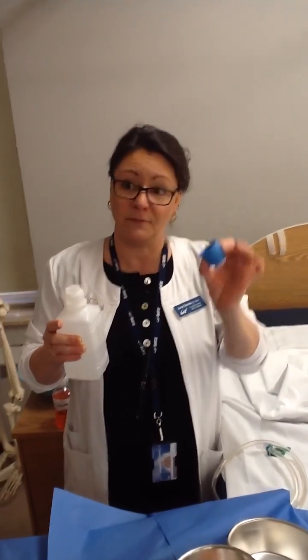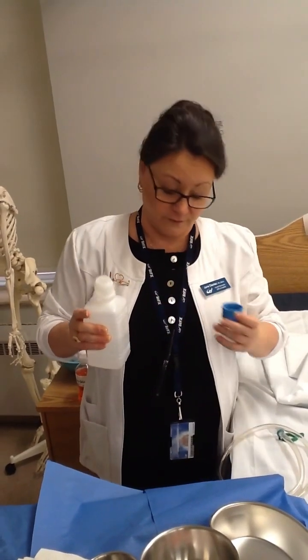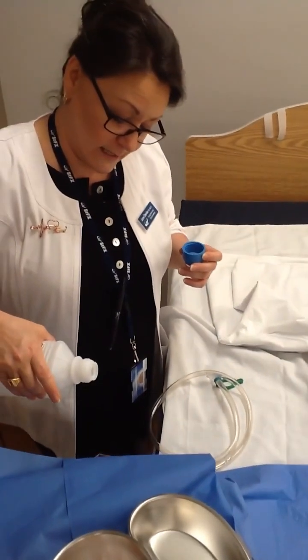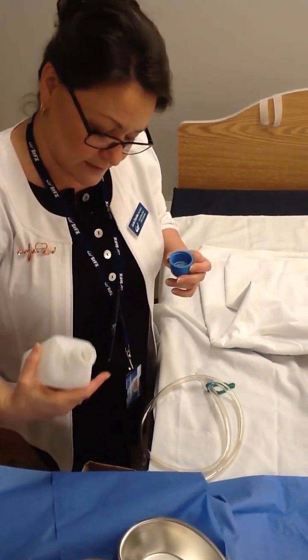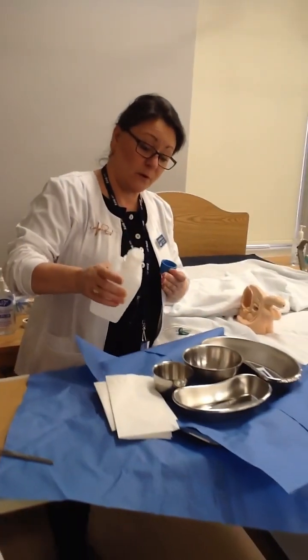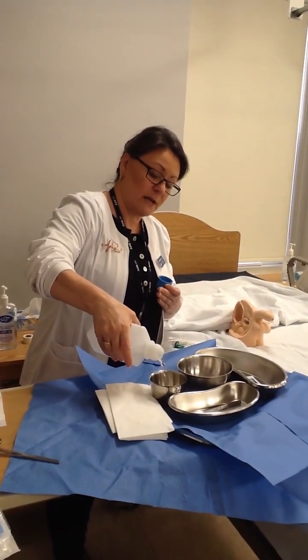There's no need to set this cover down. Just hold on to it, keep it up, don't let anything contaminate it. I'm going to clean the neck first. I'm going to tilt my bottle so that the fluid comes towards the neck, and then as it does, just flick my wrist. And I'm just cleaning that neck. Now I'm going to advance towards my bowl, and just fill about 10 mils of water in there.